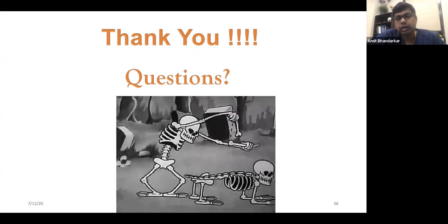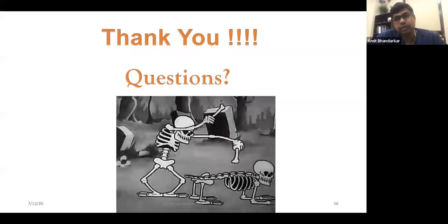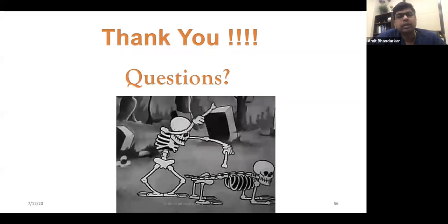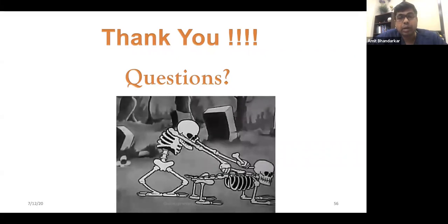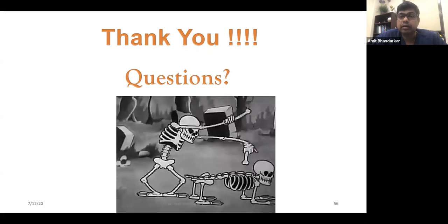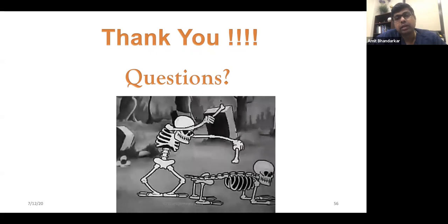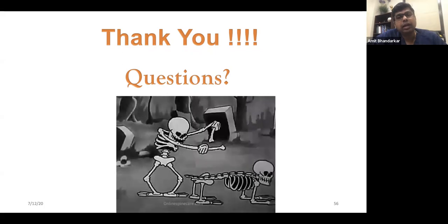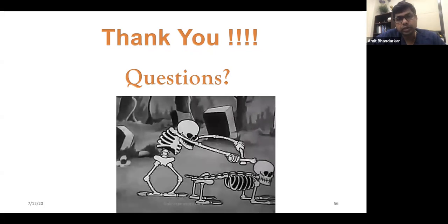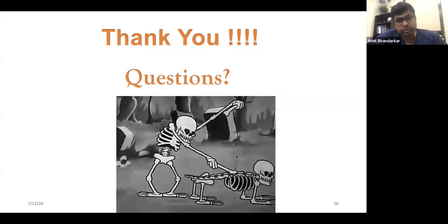Anything below that, at L4-5, if it's favorable anatomy, say it's high up above the iliac crest, I may even still do a lateral at that level. Otherwise, I will do a TLIF at other levels. ALIF is an option, but I have to find out the calendar of the vascular or access surgeon, and it's kind of a hassle sometimes. But ALIF also has definite indications as well. Usually the workhorse right now, easily done, low-risk surgery that most spine surgeons are well acquainted with, is a TLIF surgery.